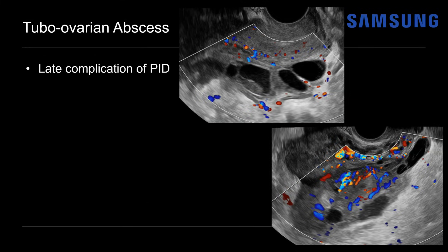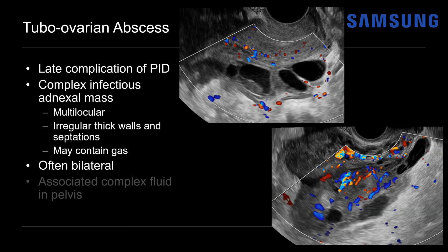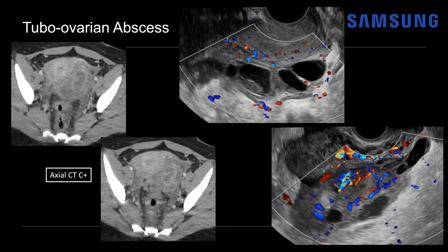A tubo-ovarian abscess is a later complication of pelvic inflammatory disease, appearing as a complex infectious adnexal mass, usually multilocular with irregular thick walls and septations. It may contain gas, appearing as bright echogenic areas with dirty shadowing or ring-down artifact — often better seen on CT. Untreated, it can evolve to bilateral tubo-ovarian abscesses. This patient's CT showed the inflammatory mass in the left adnexa with multilocularity and rim enhancement, complex inflammatory fluid surrounding it, fat stranding in the rectouterine space, and reactive rectal wall thickening.